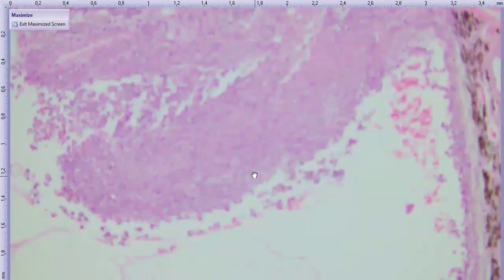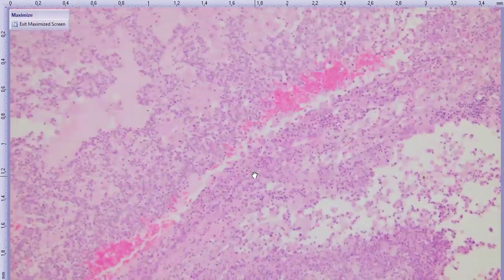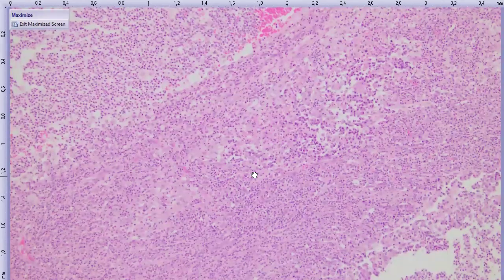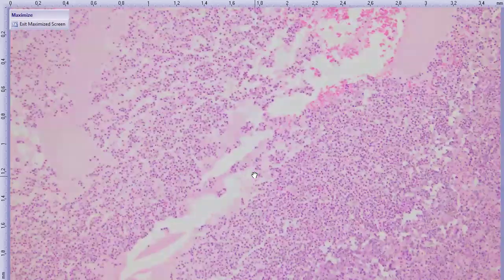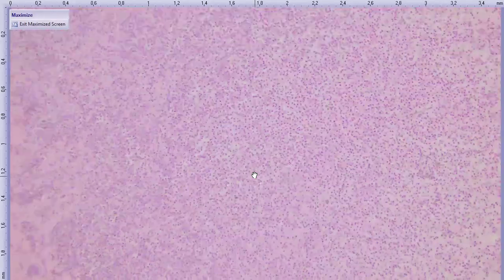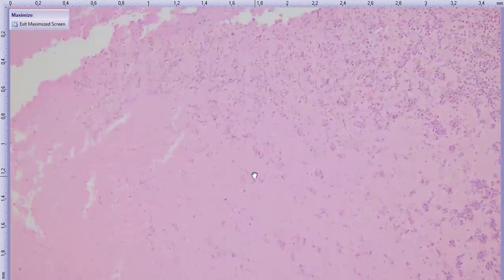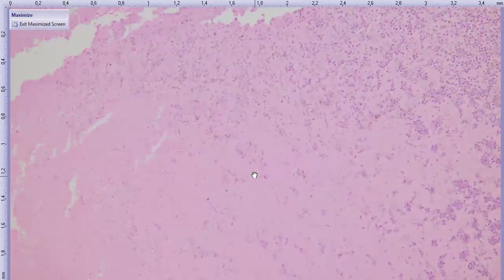So we're looking at a pyogranulomatous inflammation, which suggests something infectious. The retina disappears, so there's retinal necrosis, and everything becomes a sea of pus. So, degenerated neutrophils, and has anyone seen anything yet? Has anything caught anyone's eyes already? Kind of a dirty background, right?